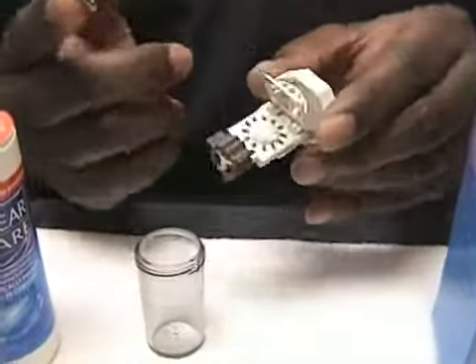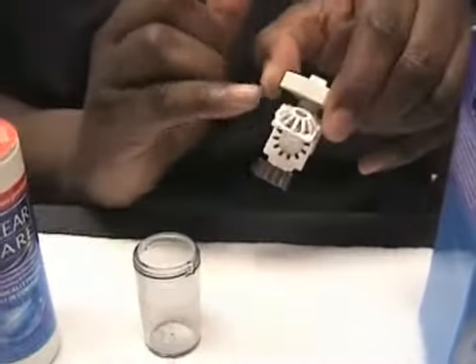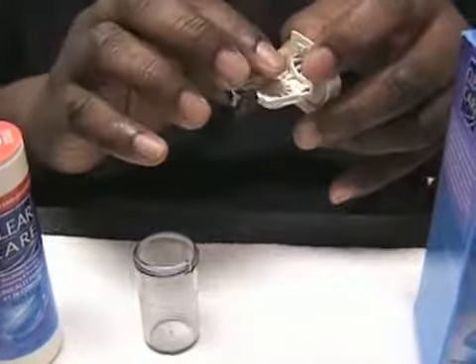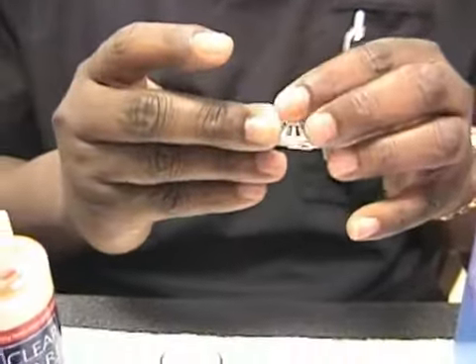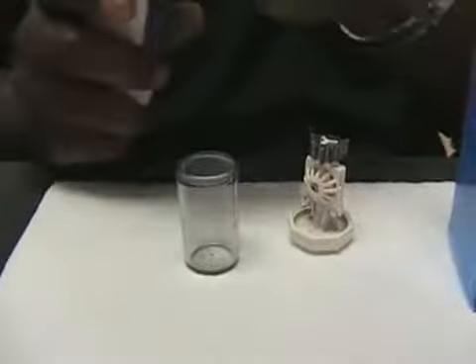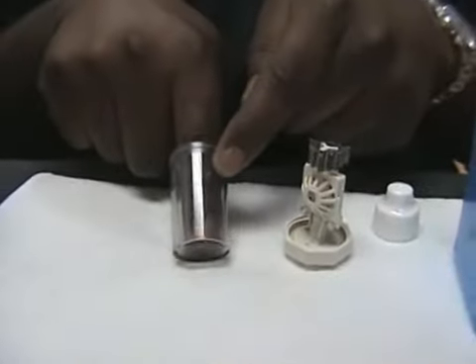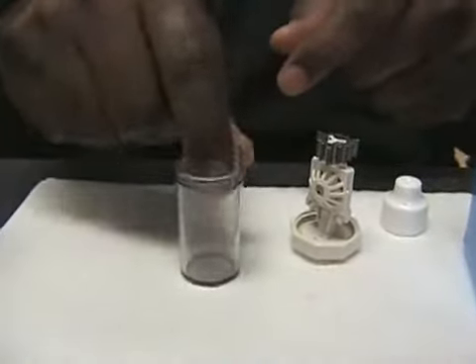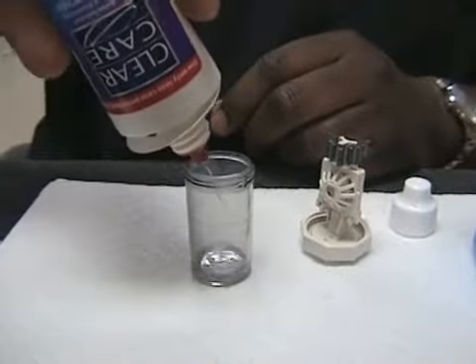But what you're going to do, you're going to take your case. It's a little flip-top case there. You're going to put the contact lens. There's an R for the right. Put the contact lens in here, just like that, in the little basket. Close it up. Okay. You're going to take the solution and fill the case up to the halfway mark, just like that, right there to the tip. And then it has it right there with the solution.